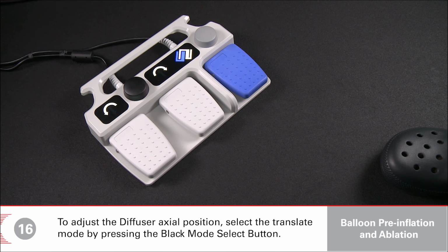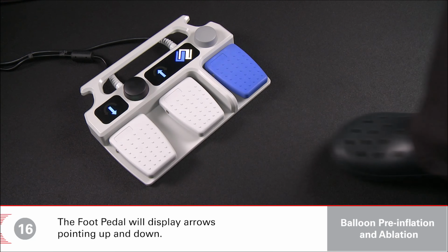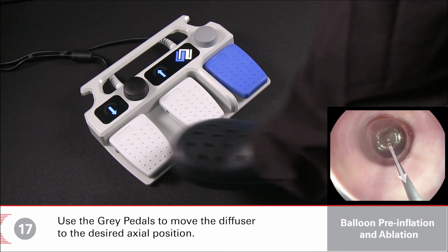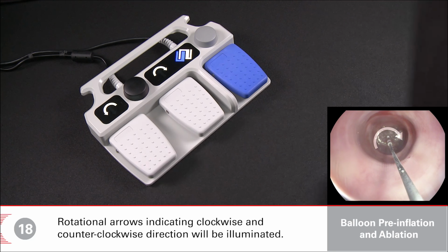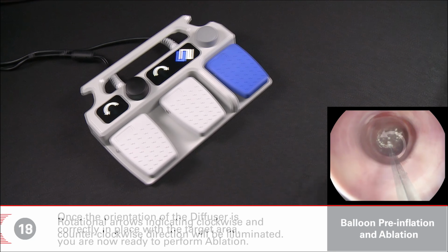To adjust the diffuser axial position, select the Translate mode by pressing the black Mode Select button. The foot pedal will display arrows pointing up and down. Use the gray pedals to move the diffuser to the desired axial position. To adjust the diffuser rotational position, depress the black Mode Select button again. Rotational arrows indicating clockwise and counterclockwise direction will be illuminated.